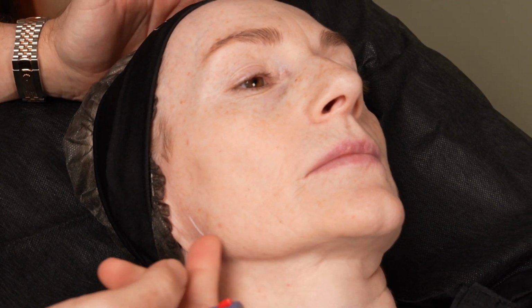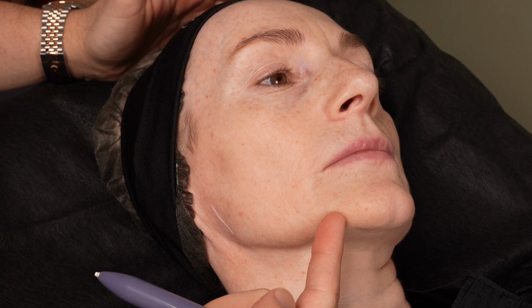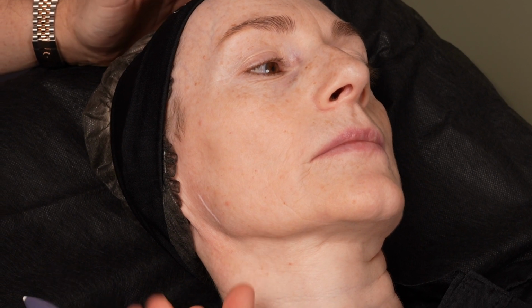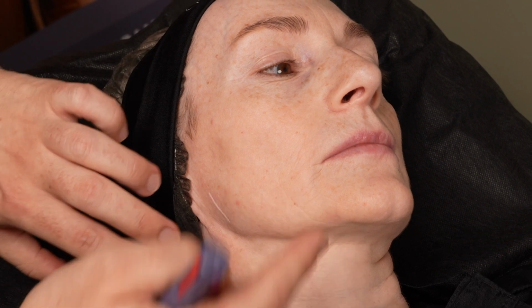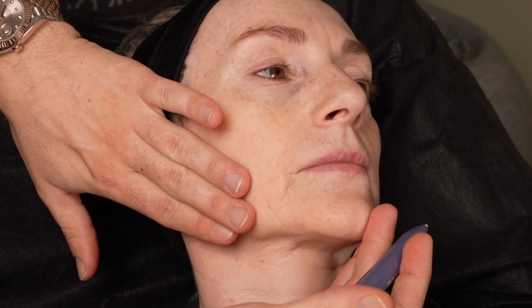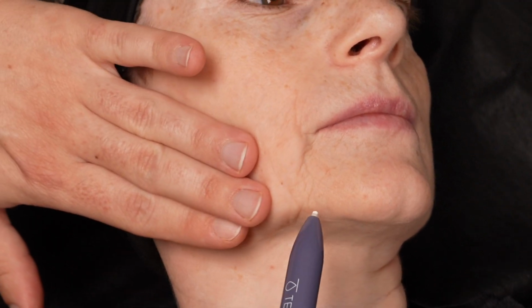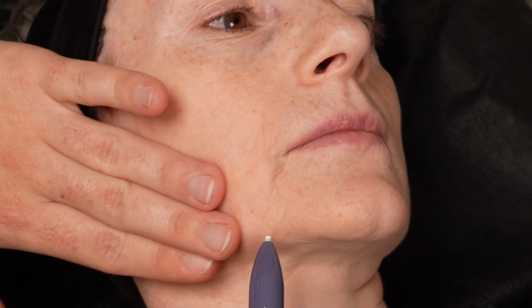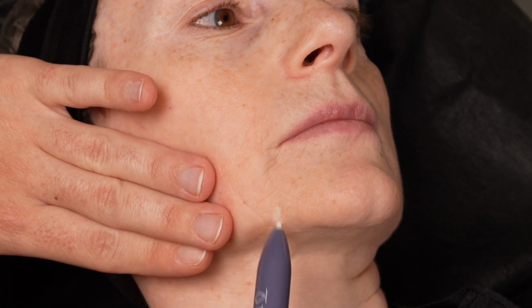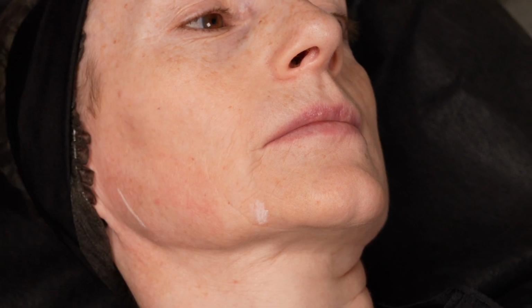Okay, in the jaw area, we have two fixed points. One of them, in the front, is the mandibular ligament. There is also the pirimasseteric ligament. How can I find the mandibular ligament? I hold the tissue, and when I move it forward, you can see here is moving, but here is not moving. You can see here. This is the mandibular ligament, the first fixed point of the lower part.